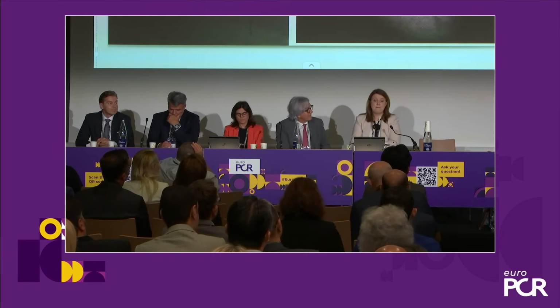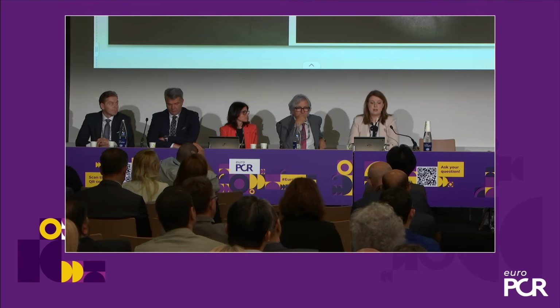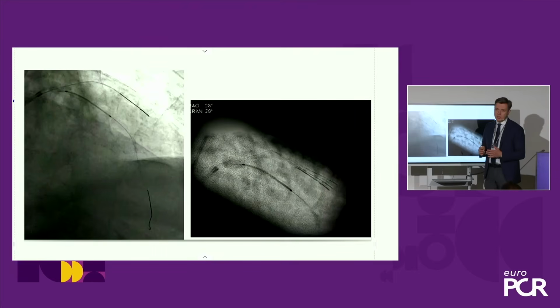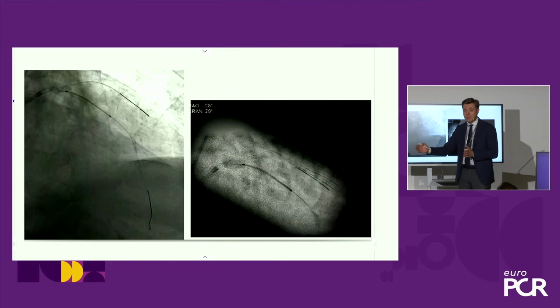Yeah, so I think we can highlight a difference or a continuity of the two cases. In the first, there was a strong highlight of the planning. And in the second, you could see the benefits of the planning with IVUS, but also with the co-registration. And it really helps you. And I think what the second case added is this component of instantaneous guidance.